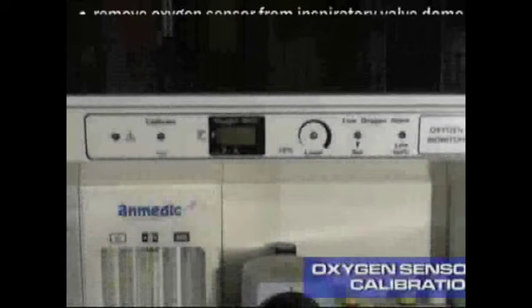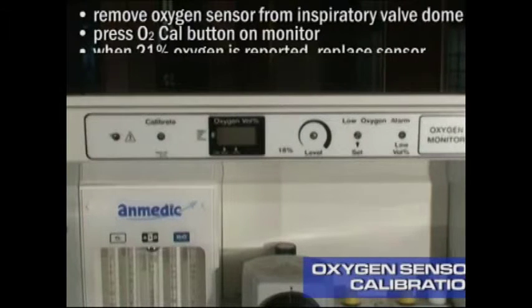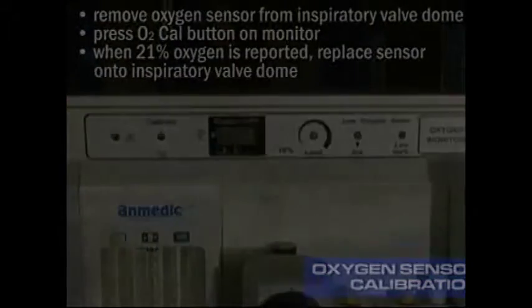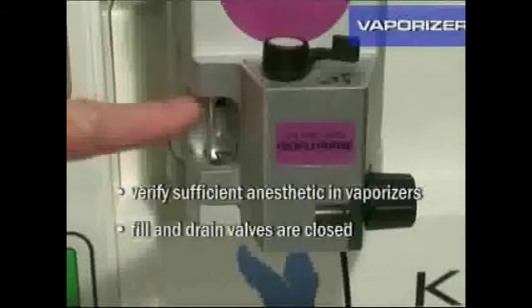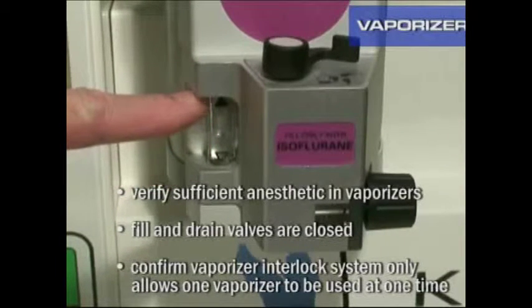Remove oxygen sensor from inspiratory valve dome. Press oxygen cal button on monitor. When 21% oxygen is reported, replace sensor onto inspiratory valve dome. Verify sufficient anesthetic in vaporizers. Fill and drain valves are closed. Confirm vaporizer interlock system only allows one vaporizer to be used at one time.